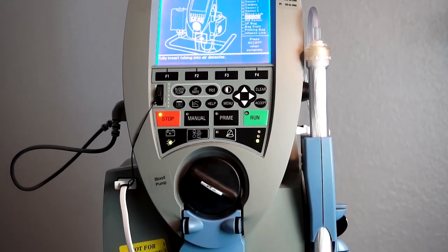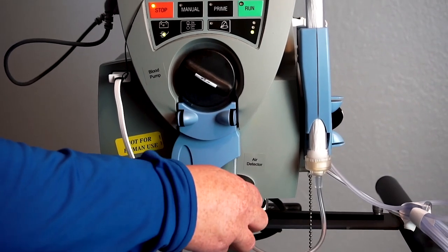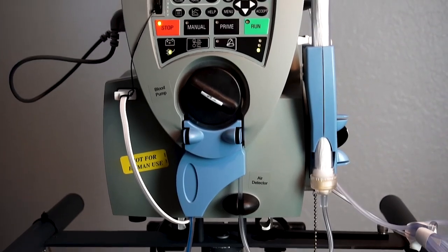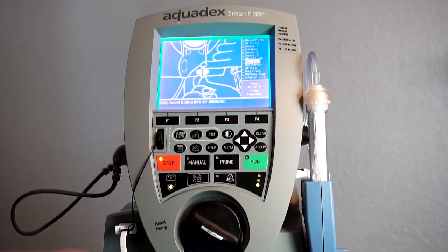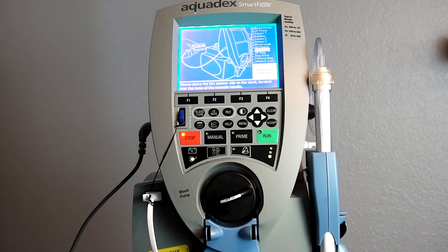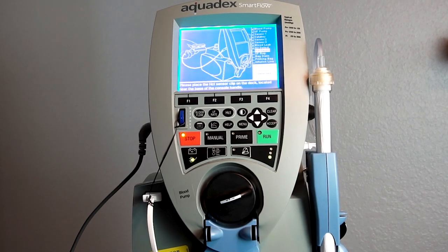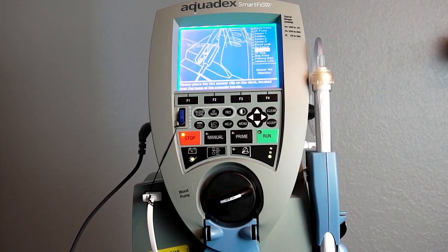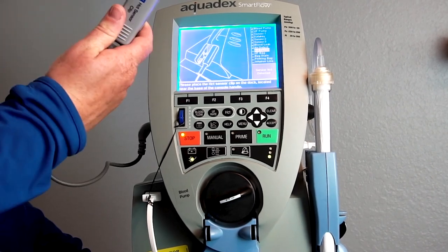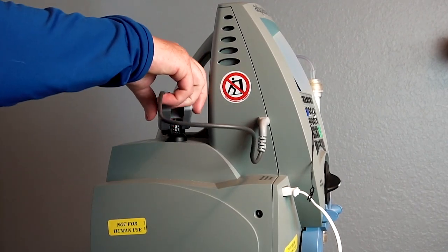Next, place the tubing in the air detector, which is located below the blood pump. Press accept when complete. Place the hematocrit sensor on the hematocrit sensing dock on the back of the console, and make sure it clicks into place.